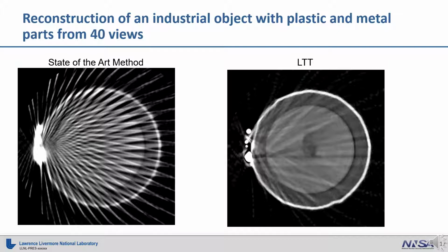Another common thing, an algorithm that has been developed over many years, is what they call metal artifact reduction. And it's basically that when you image metals next to like soft tissue of a body or plastic parts, it causes these streaking artifacts that really diminish the diagnostic quality of the image. But like I said, conventional X-ray CT is like 1,000 projections.